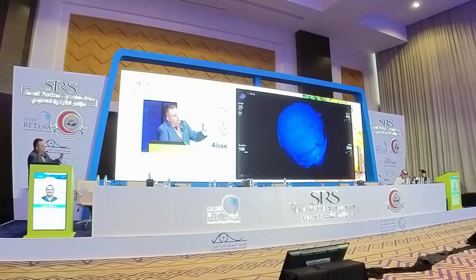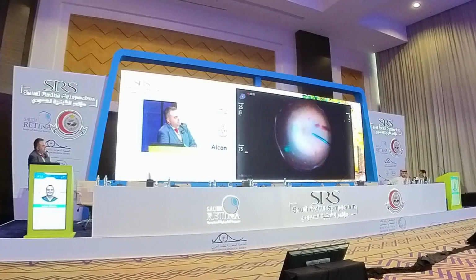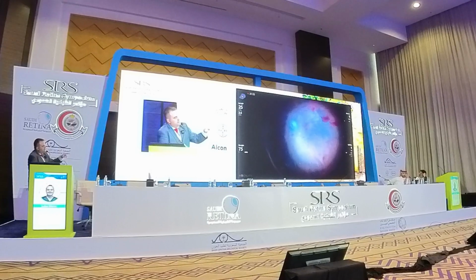I'm just showing how we might miss some spots, especially around the trocars during our surgery, since the normal vitreous is absolutely transparent. So there are different types of filters for highlighting the fundus. This is not a natural image of the fundus. And later on, this is a blue-based filter, something that Alcon will provide in version 1.5 of their software, which they call Blue Boost.